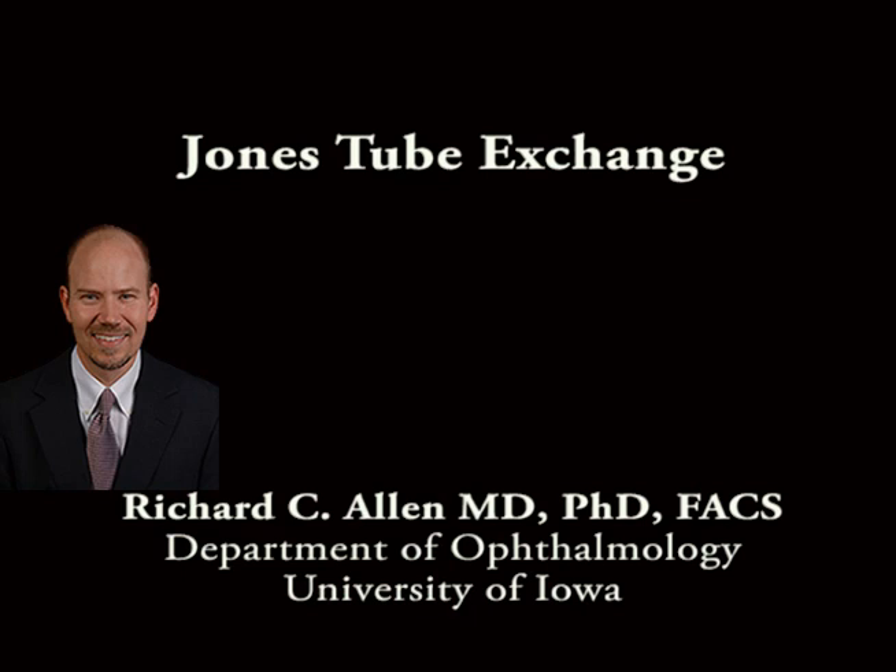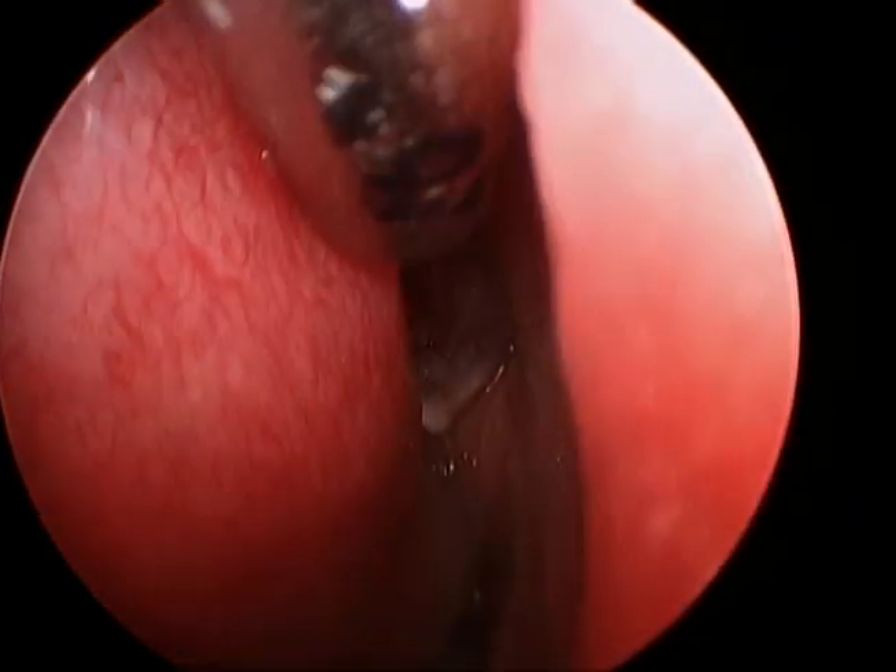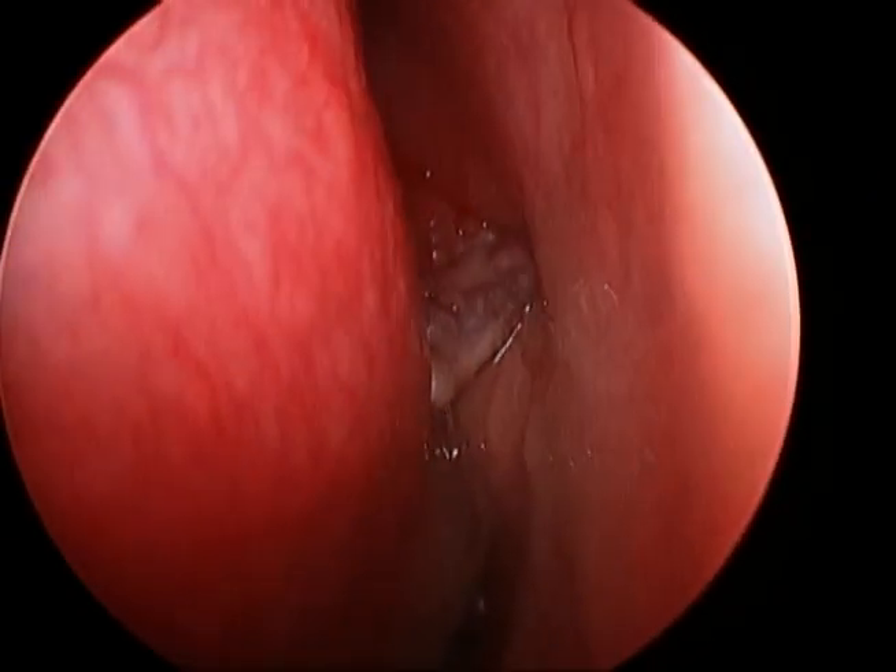This is Richard Allen at the University of Iowa. This video demonstrates the exchange of a Jones tube. Examination of the tube in the nose shows that it is too long and is obstructed by the nasal septum.